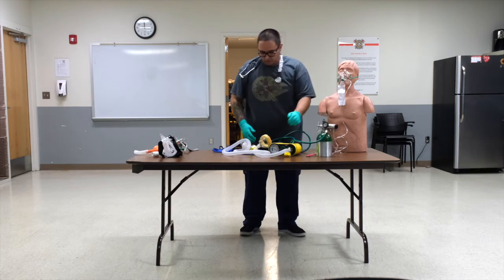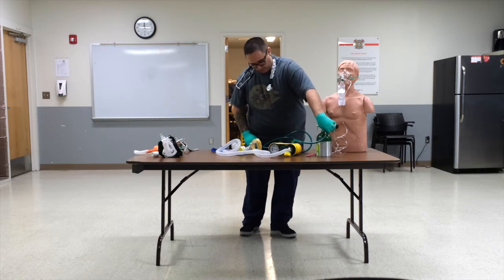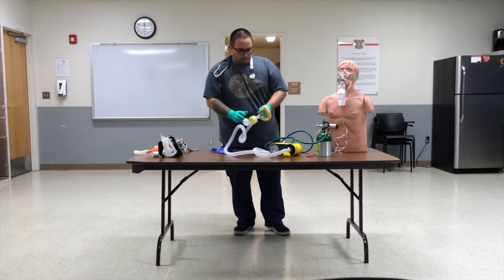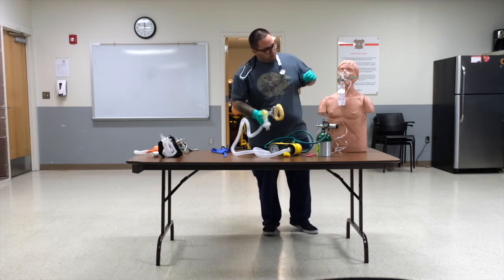It's very loud. It's going to sound like air is rushing through it. You're also going to hear every leak that's in the connection ports, so make sure that everything is tightened down really well. From here, we're going to instruct the patient, and we're going to inform them that we're going to put the mask on their face.